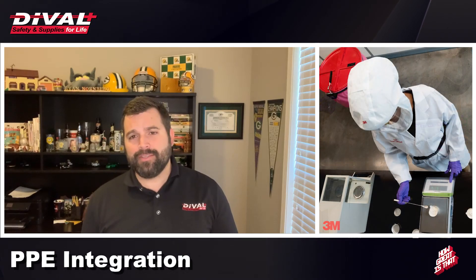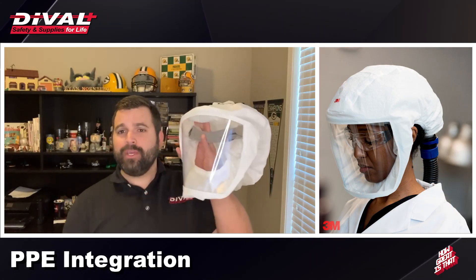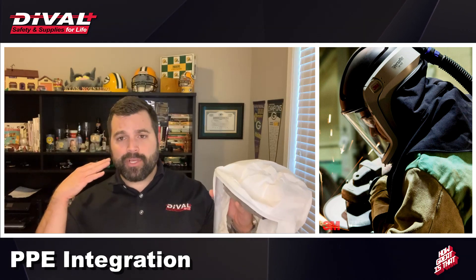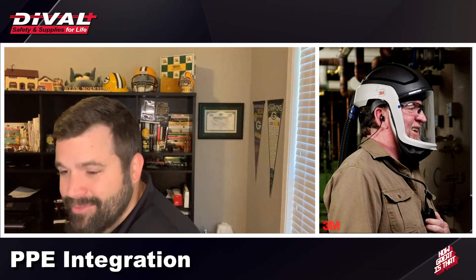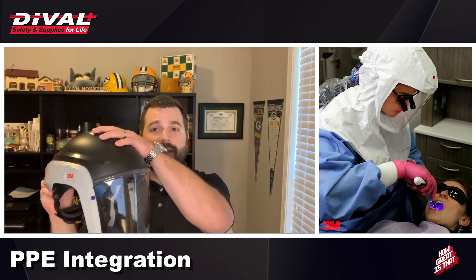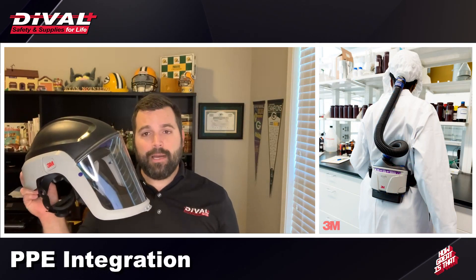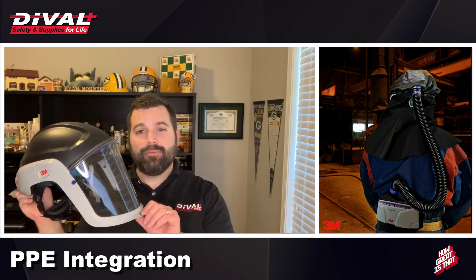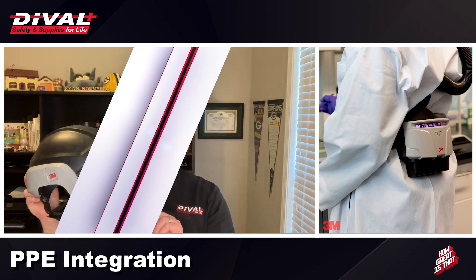By using a PAPR device, your PPE integration is greatly simplified. Even in the most basic form, your respiratory needs are covered, but it also allows you to utilize your favorite eye protection and hearing protection in the same environment. For environments needing even greater protection, there are fully integrated solutions providing top-of-head protection, full face protection, and various shield options. There's no situation where a PAPR device can't provide respiratory protection and integrate with all the other pieces you need to stay safe.